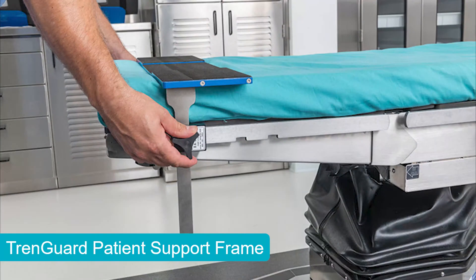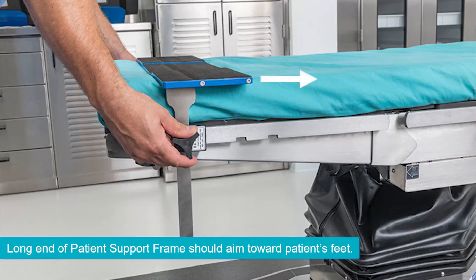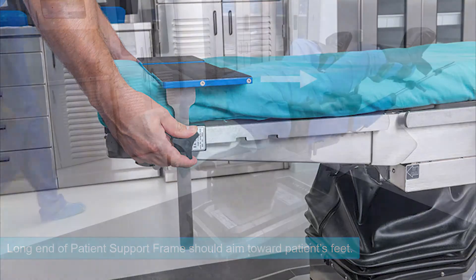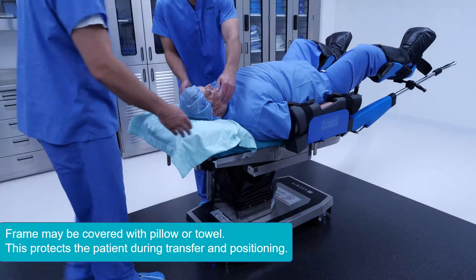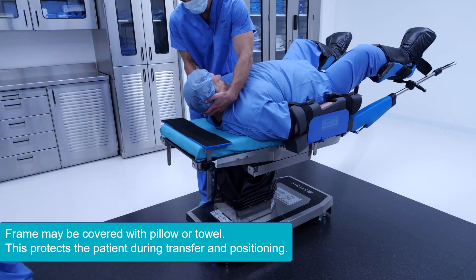When placing the frame on the table, aim the long end toward the patient's feet. You may want to cover the frame with a towel or pillow during patient transfer and positioning.